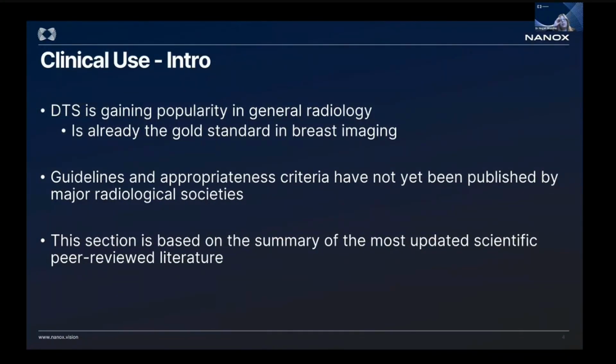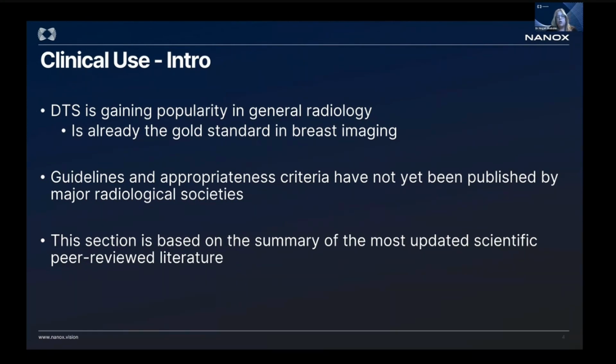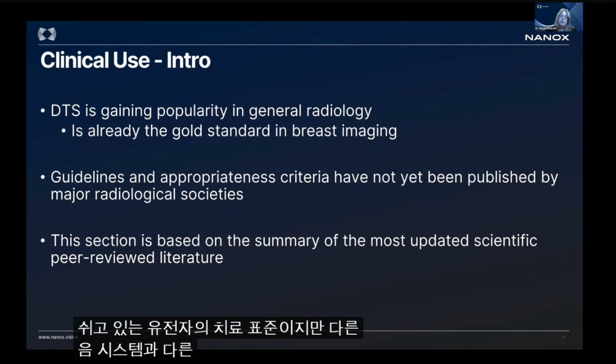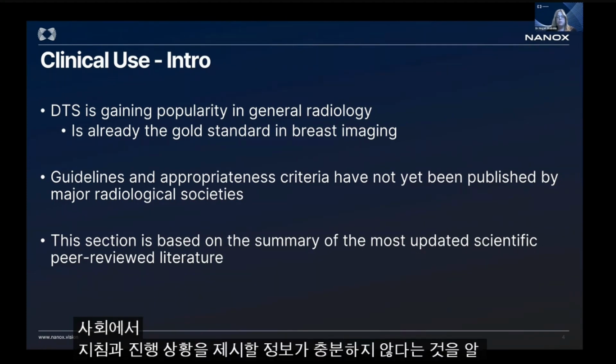In general, about tomosynthesis, most of you have heard about digital tomosynthesis in the setting of breast imaging. This is already the standard of care in breast imaging. But in the other radiological applications, there's literature, but there's not enough information for the societies to come up with guidelines and appropriateness criteria.